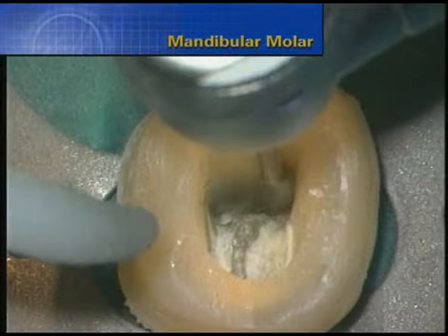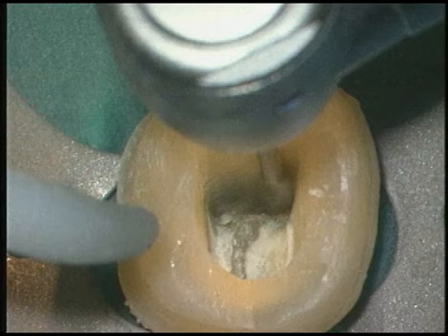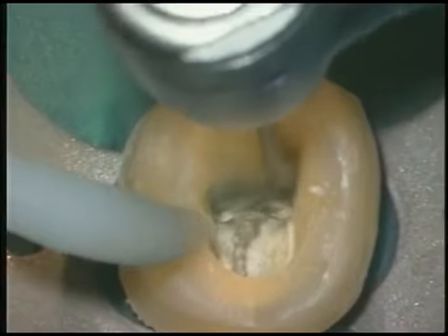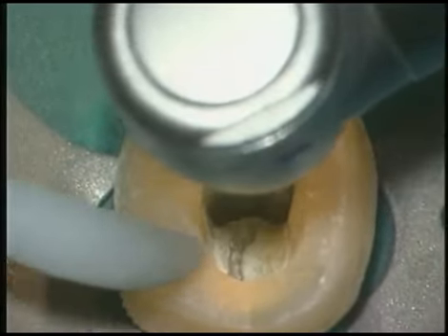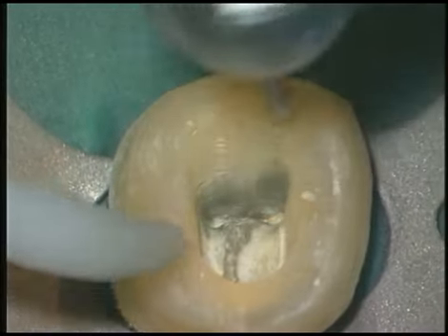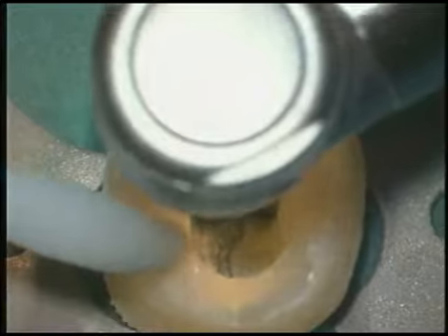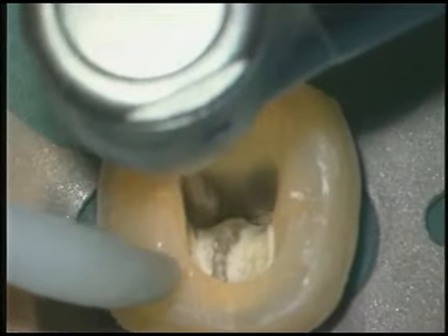In this mandibular molar, we removed the clinical crown to improve access. A preoperative film revealed a deeply positioned, broken instrument around the curve and close to the furcal side concavity. There's been a continuous discussion about the importance of great coronal and radicular access. Gates-Gliddens and diamonds are used to establish this access. Larger GGs are used to face off the orifice.